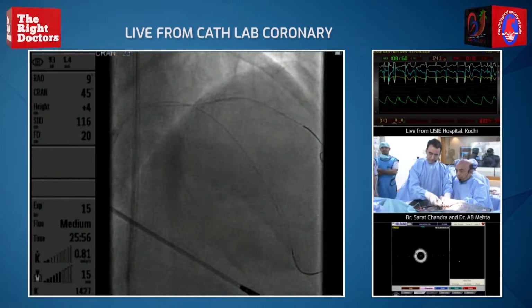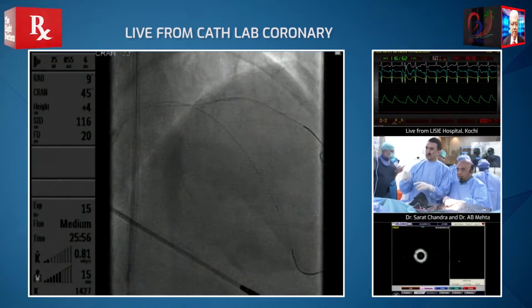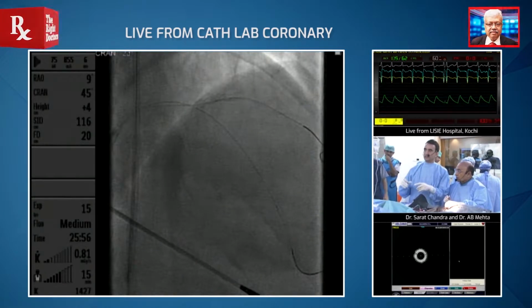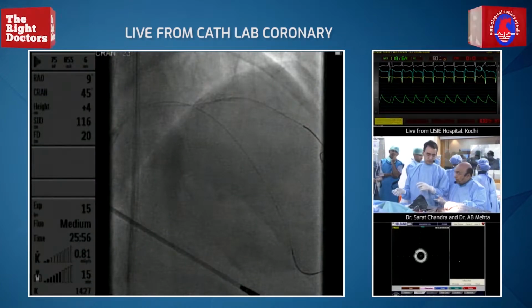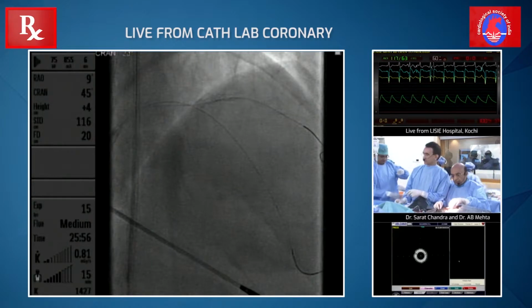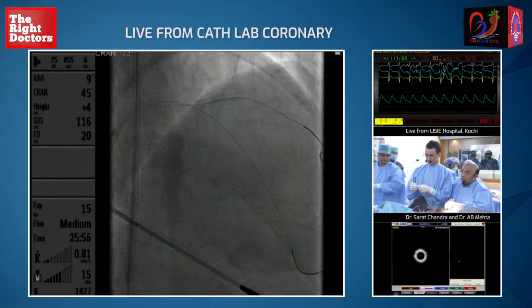The lesion is a little too complex to leave it at this stage. We thought, in fact, you see the result now, it goes on to support that initial stenting directly is a good idea. Give a 2, or even 2.5 is fine. A 2 balloon is fine. I'll open the strut. This will go, sir. This is in very good shape.